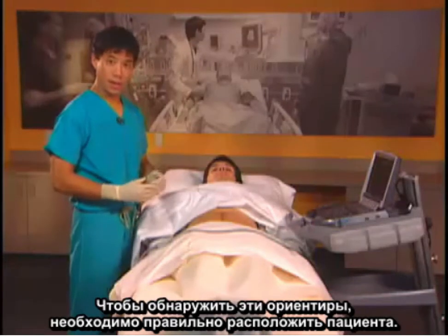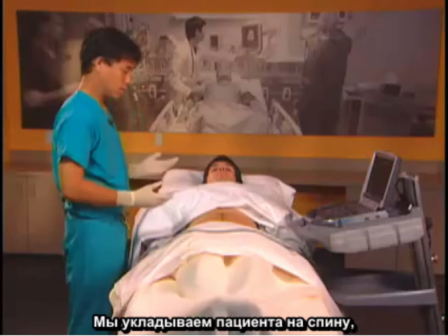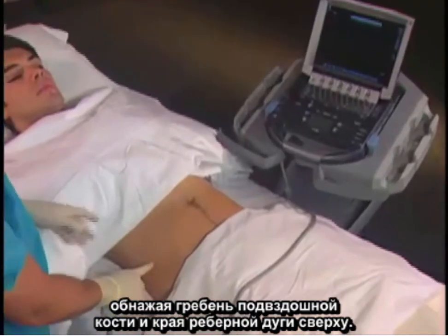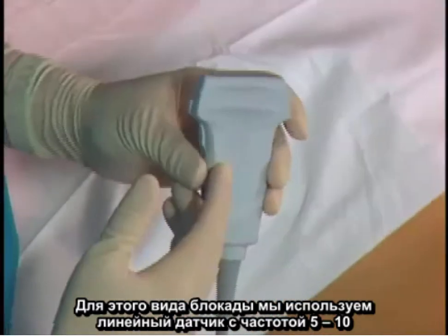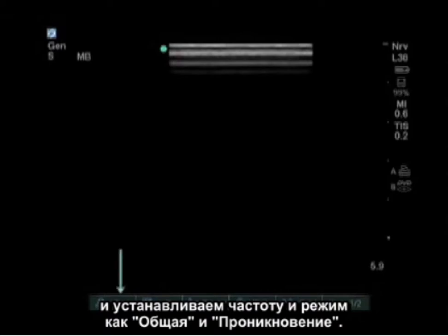In order to find these landmarks, we should position the patient properly. We have the patient completely supine, expose the iliac crest here and the costal margin superiorly. We use a linear probe for these blocks with a frequency of 5 to 10, set in the general or penetration mode.